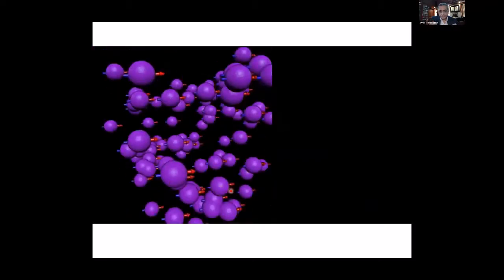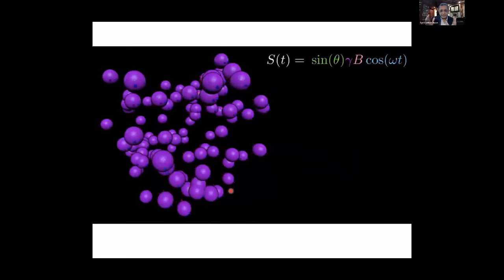And it's not only one molecule. There are billions of molecules, billions of protons, and the signals taken from those are then put together. And I will talk about how the system works.